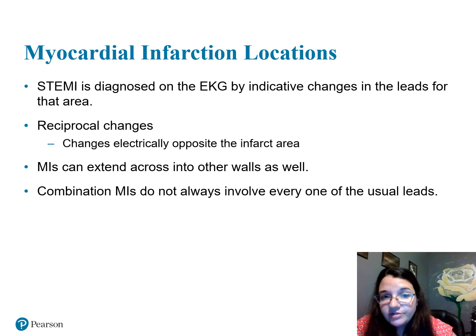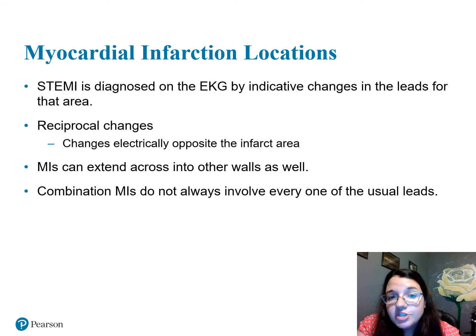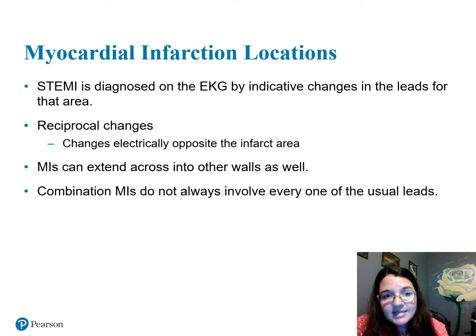Myocardial infarction locations. The STEMI is diagnosed on the EKG by indicated changes in the leads for that area. A reciprocal change means opposite. Make sure you know that term. Reciprocal means opposite. This is the change of the electricity that is opposite of the infarcted area.